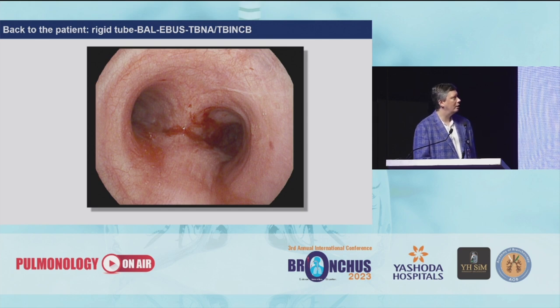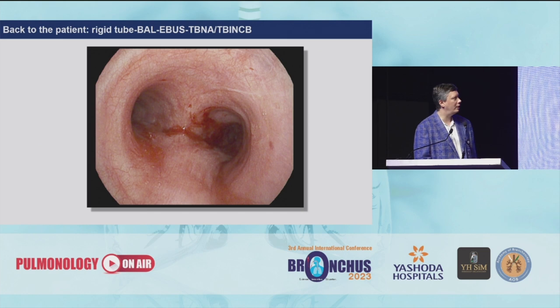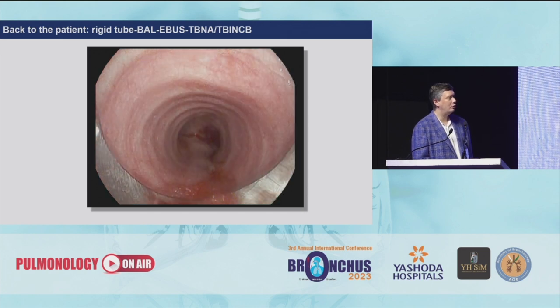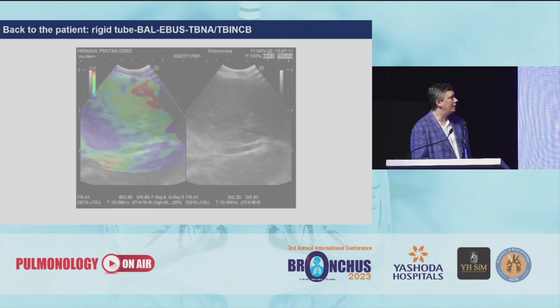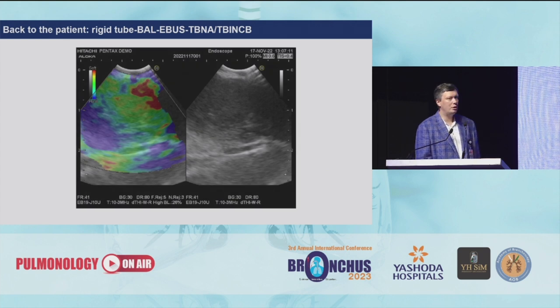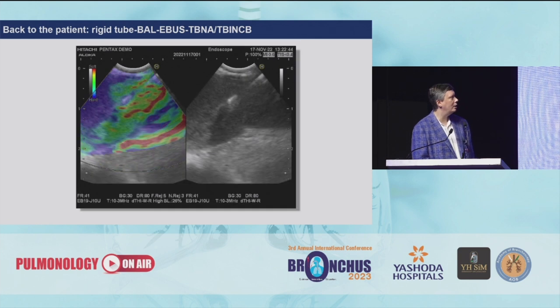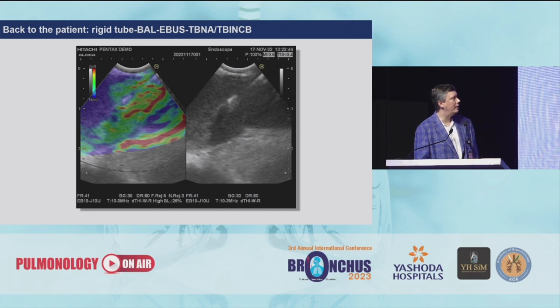There is probably nothing clinically significant for the patient because this amount of blood is not definitely clinically significant. Afterwards, before extubation, we have a look through the video bronchoscope of high definition. Here you see the moment of extubation. We see a huge lymphatic node behind the wall — probably mostly benign up to the information of elastography. You can see the cryoprobe performing the biopsy directly under elastography control.